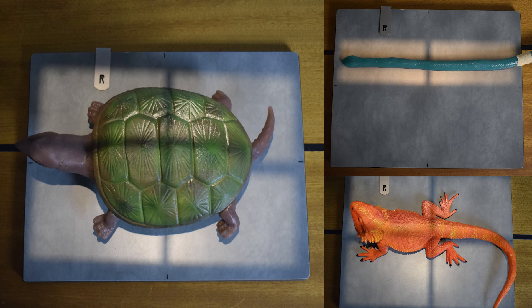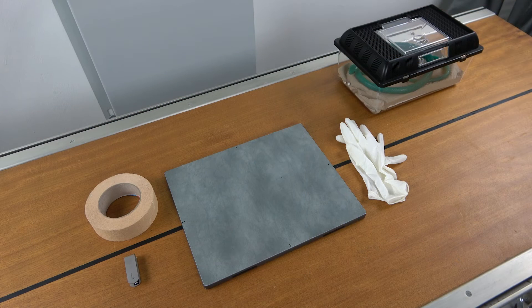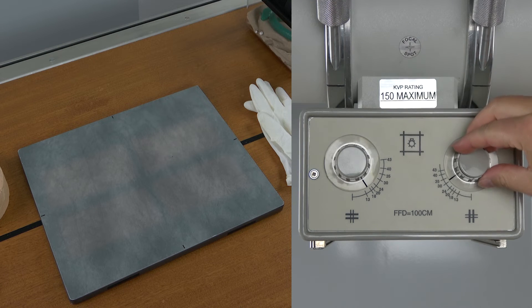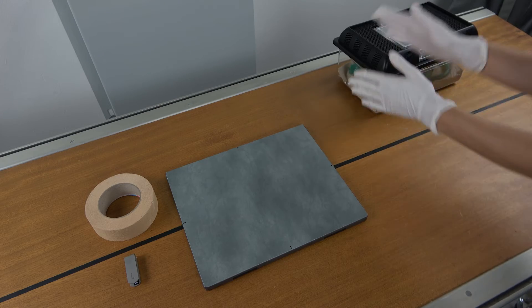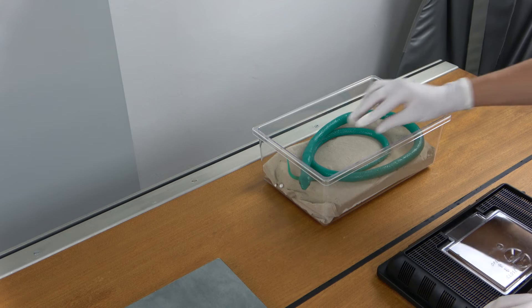Correct positioning of the patient is essential to be able to interpret x-ray images well. Anesthesia is usually not necessary. The animal is brought to the x-ray room in the transport box. The room is darkened and the x-ray plate is positioned in the field of light of the x-ray machine. The x-ray machine and the field of light are adjusted appropriately depending on the species and size of the animal. All materials required for each animal are prepared and laid out. The gloves are put on and the animal is placed on the x-ray plate.